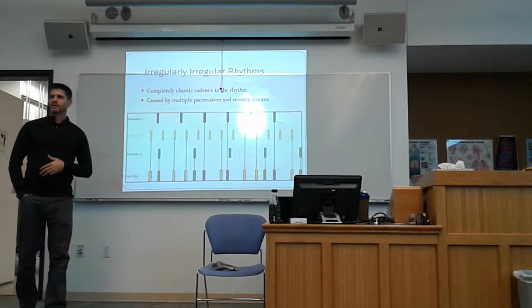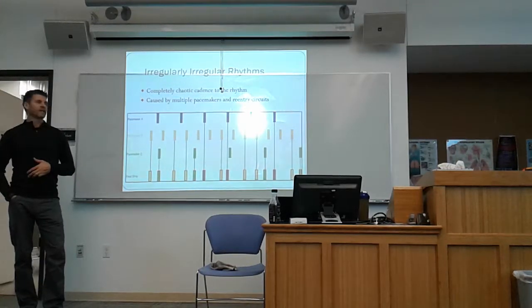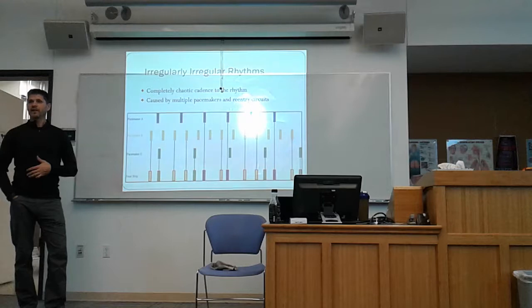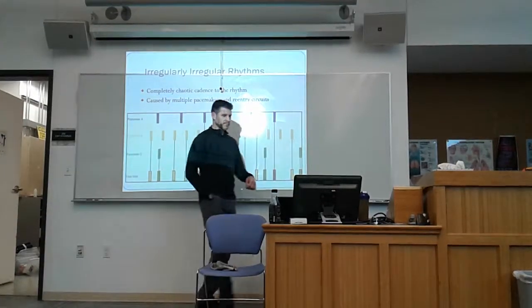Could you ever have regularly irregular AFib? No. It is the one rhythm, which we'll come to later, that is always irregularly irregular, and the only one that is always irregularly irregular. Okay.